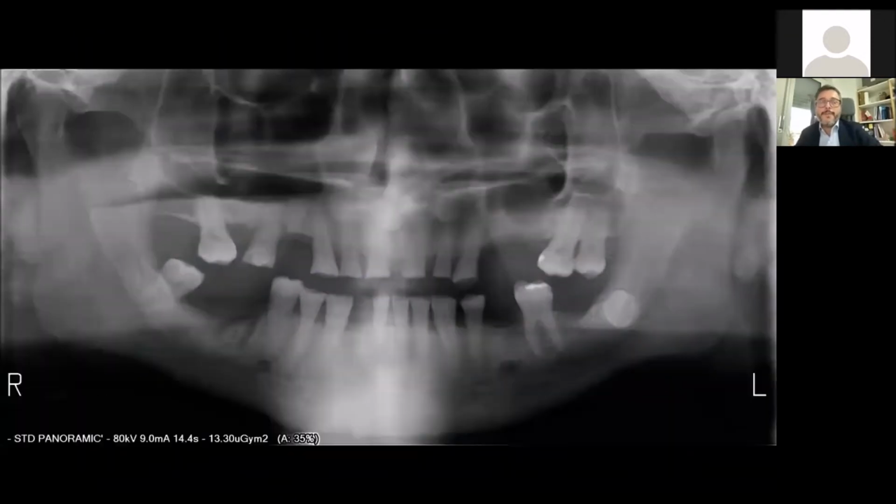All normal anatomical landmarks are by no means demonstrable in any given radiograph. In fact, some are visualized in a small percentage of cases only. However, the dentist should be familiar with them so they can be identified and correctly interpreted when they are visualized. There are also wide structural variations that are within normal limits.